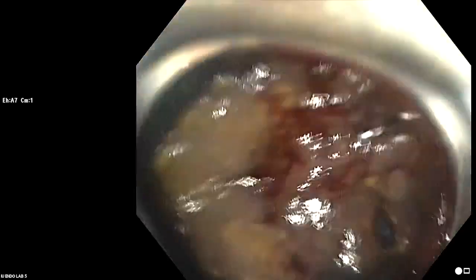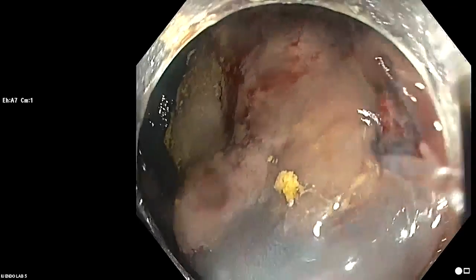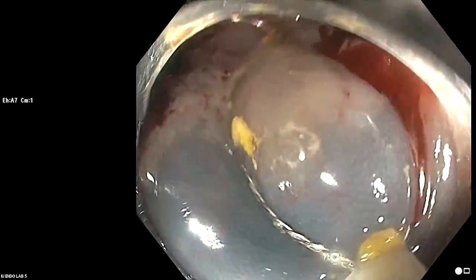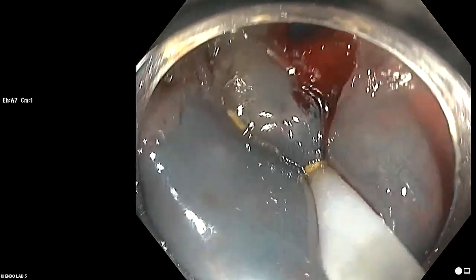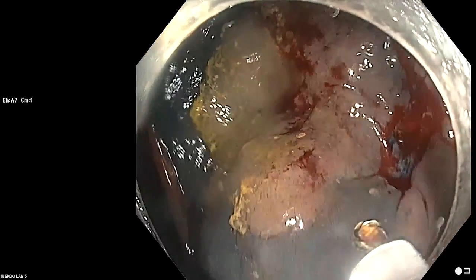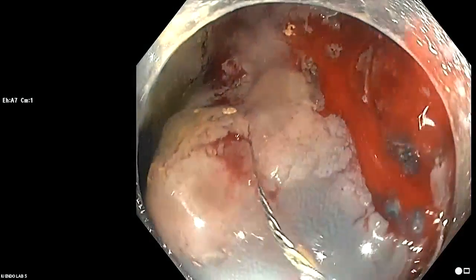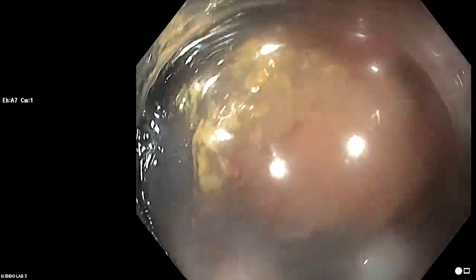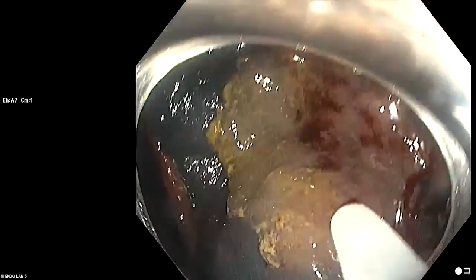We've got to dig in, we get that initial bite, and then we can use the water jet to expand the space a little bit, open. And again, margin over the submucosal defect on the right, and a margin at the edge of the lesion, close and cut. And I usually will suck up the pieces as we're going, open, unless there's a million of them and they're all falling in the same direction. We can just pick them up later. So you can see right here's a little bit of serrated gland right along the edge of the polyp, close and cut. And we basically have no limits on how big we want to make that margin, open.